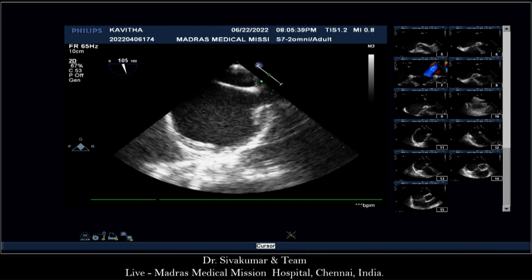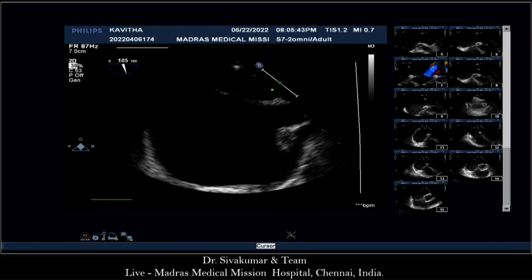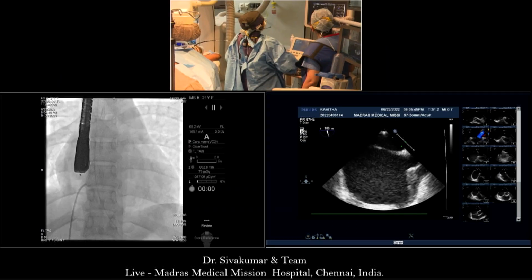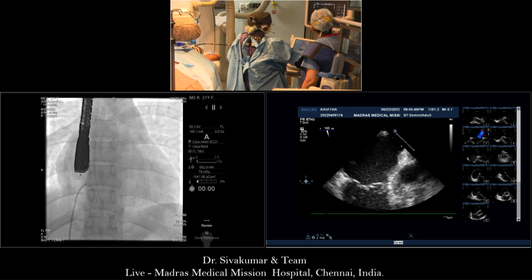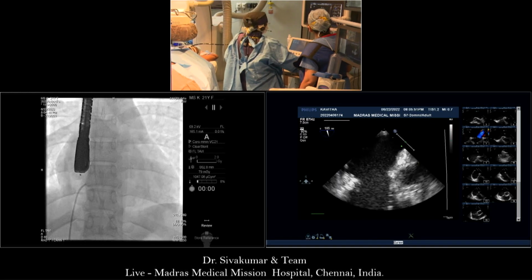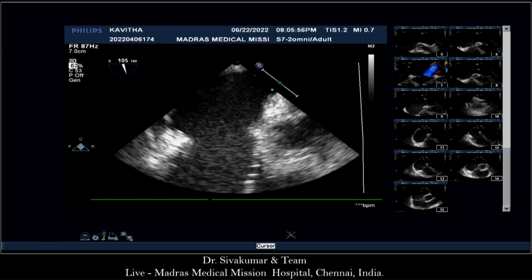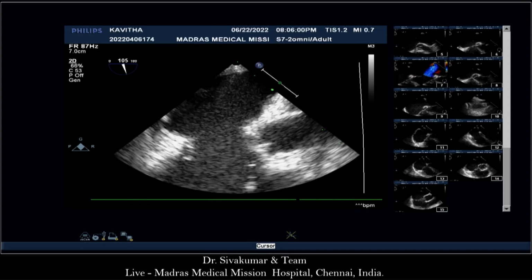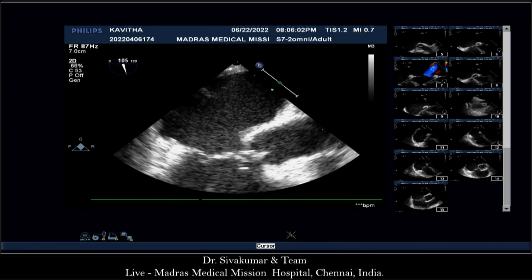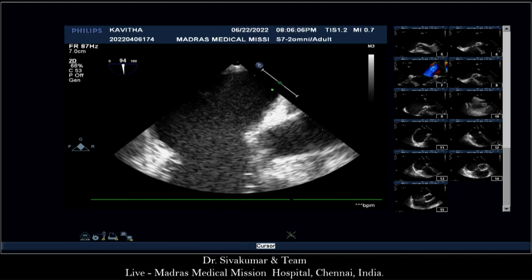I want the stiff wire again. So just on that aortic rim that you were measuring. You mean bicaval view? No, in the sort of 60-degree view, it was where you measured with the aorta. It was slightly more into the left atrium where I might have measured it. Good learning for the audience. Yes, there is some amount of atrial septal malalignment.